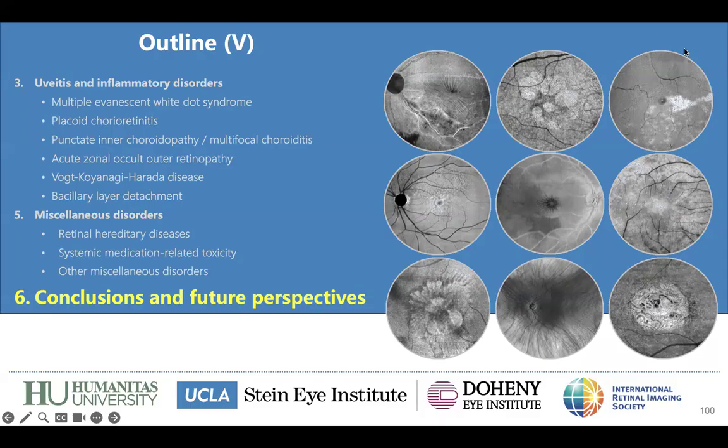In a normal eye, the lowest point might be in the nuclear layers, and we can have a perspective of the outer nuclear layer mainly and fluid position. What do you think about this kind of imaging and the possible applications?